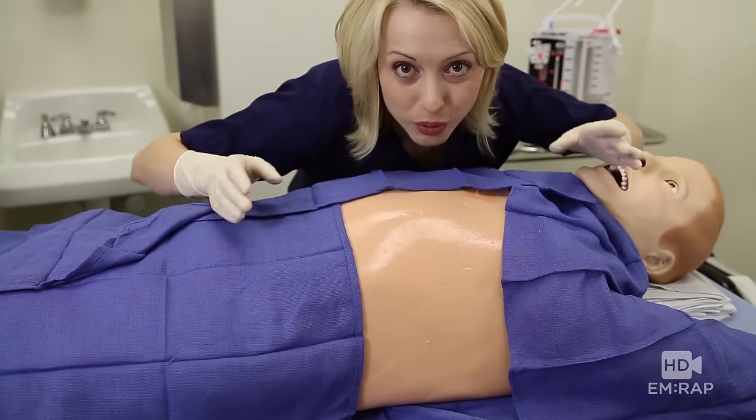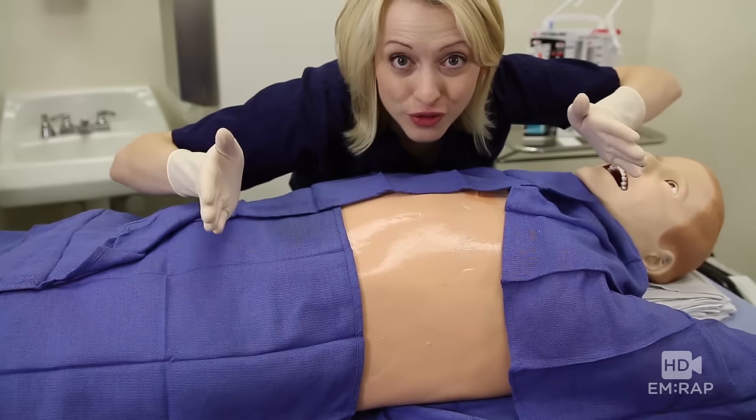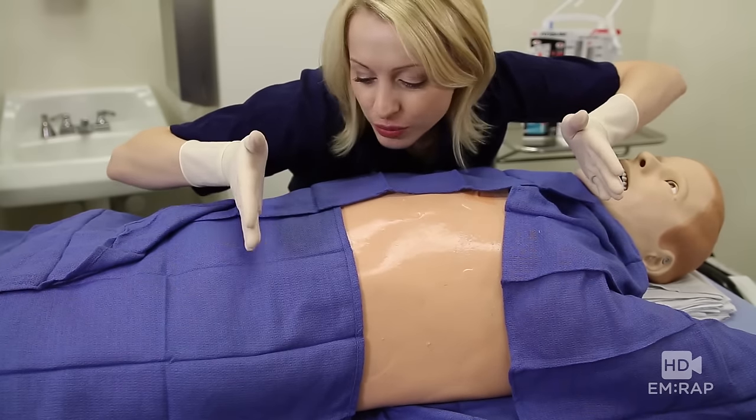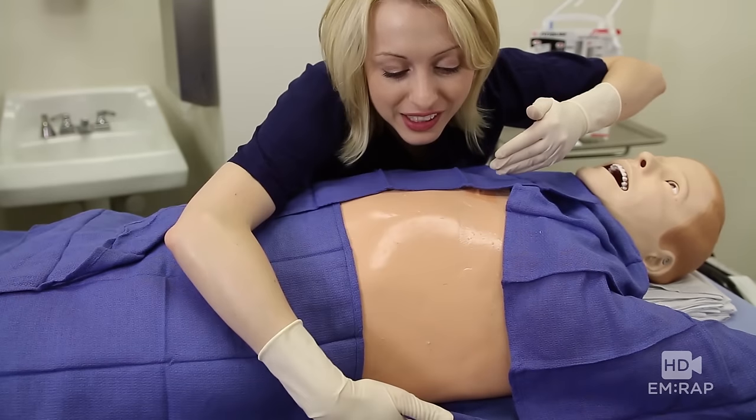Once you're sterile, prep and drape a wide area to keep a large field visible throughout the entire procedure — from clavicle to costal margin, sternum to mid axillary line.